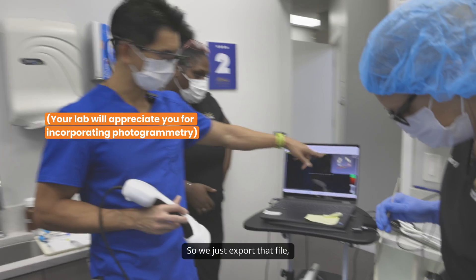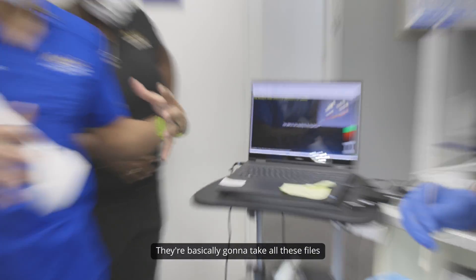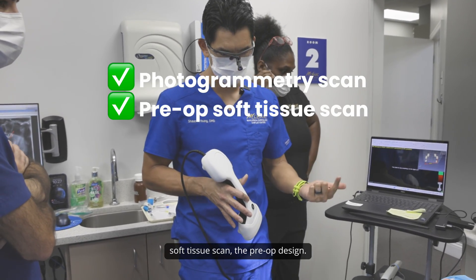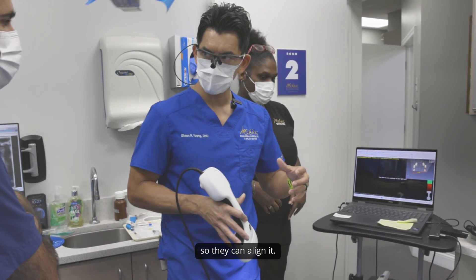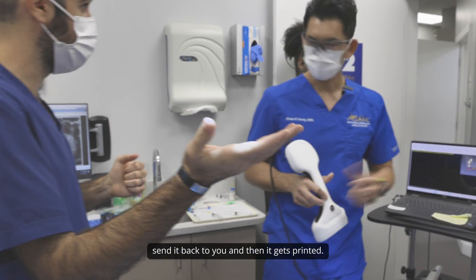We just export that STL file and upload it to Dropbox. The lab will get it immediately — they're going to take all these files and merge them together in their CAD/CAM software. They'll take the photogrammetry, the soft tissue scan, and the pre-op design. We'll also get a final soft tissue scan with the reference screws so they can align everything. Then they'll come up with the design, send it back to you, and it gets printed.